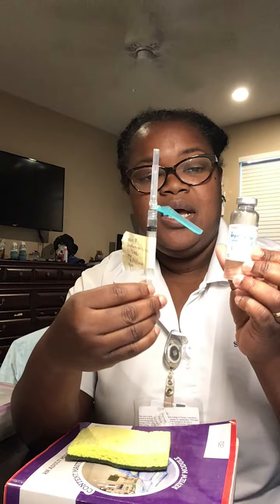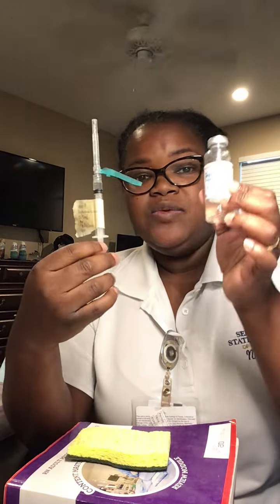Oh, before I put on my gloves, I have to do my third check with my patient. Okay, I'm going to make sure that I have my influenza vaccine. I'm going to use the intramuscular injection. This is annual.